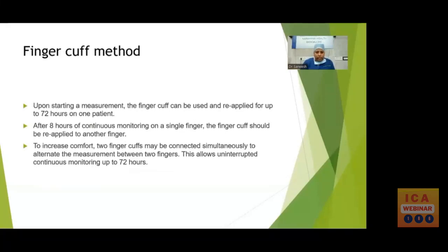Upon starting a measurement, the finger cuff can be used and reapplied for up to 72 hours on one patient. After 8 hours of continuous monitoring on a single finger, the finger cuff should be reapplied to another finger. To increase comfort, two finger cuffs may be connected simultaneously to alternate the measurements between two fingers. This allows uninterrupted continuous monitoring up to 72 hours.